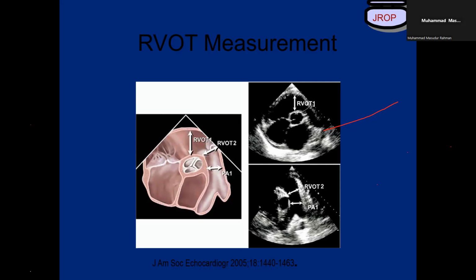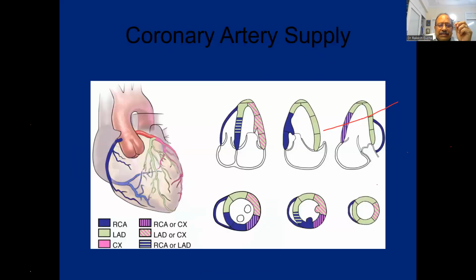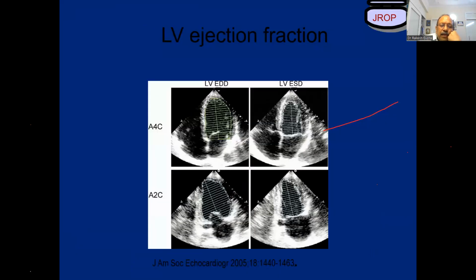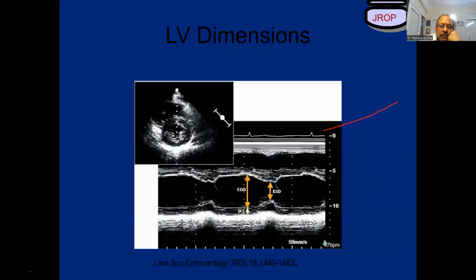So yes, we measure our dimensions during diastole, and we see just a minimal line-like structure of endocardial thickness during diastole. So we do include it, let me go back to this picture again. Look, this is a line which you see over here, correct?